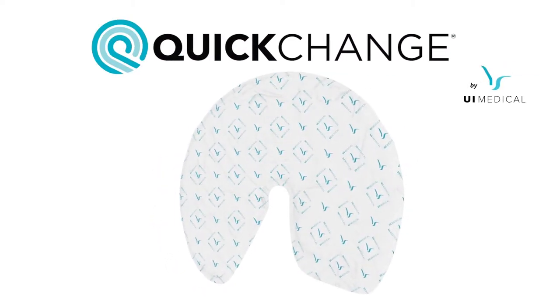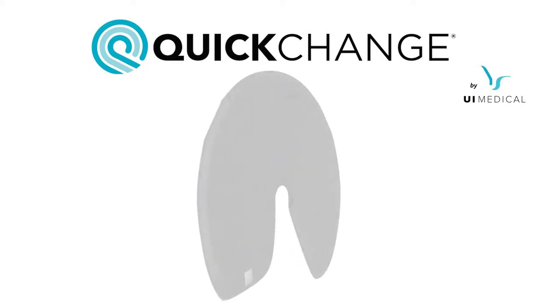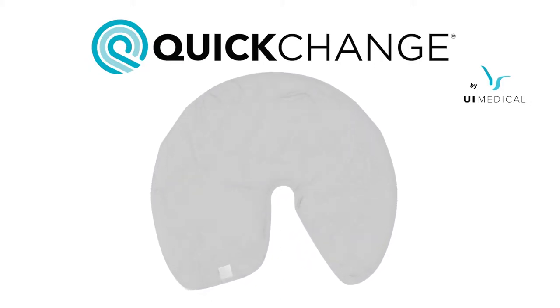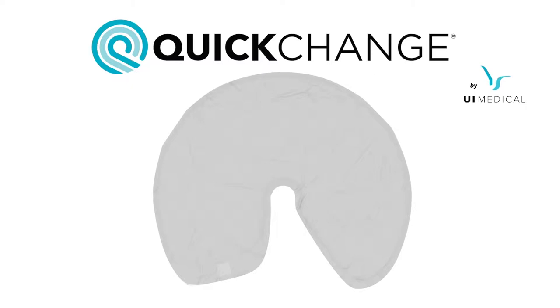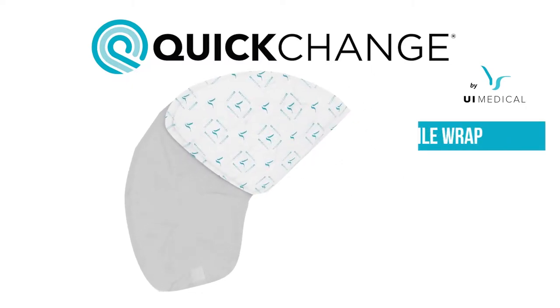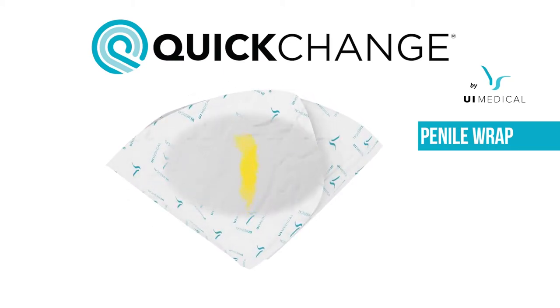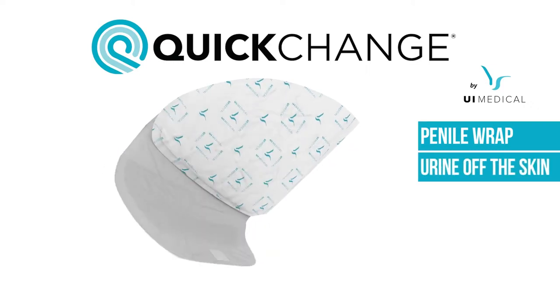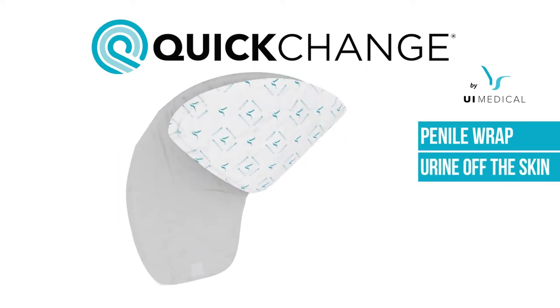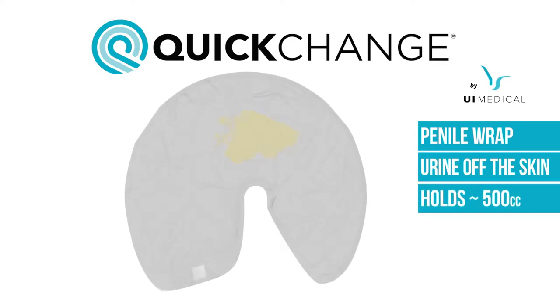The quick change wrap is a new type of incontinence device taking the absorbing and disposable aspects of an adult brief and merging it with the discreet, localized nature of a catheter. The end result is known as a penile wrap. Wraps fold around a male patient's penis and collect urine as soon as it is voided, keeping the urine contained and off the skin. Wraps are dry to the touch within seconds and hold about 500 cc's.